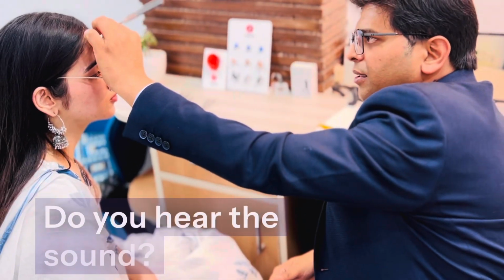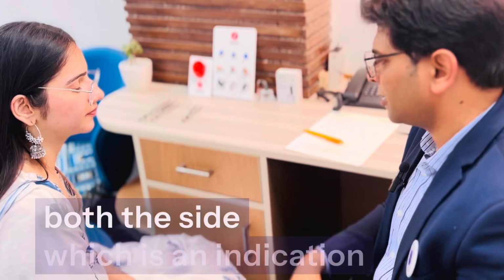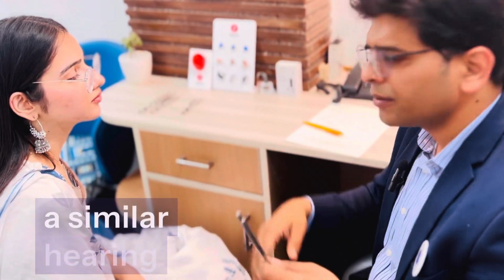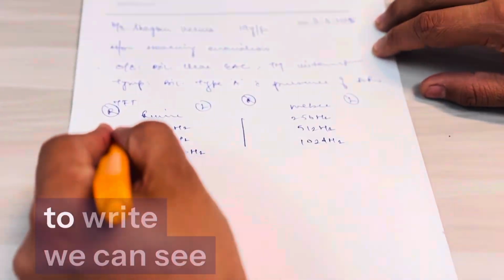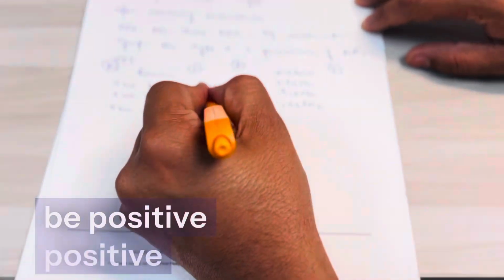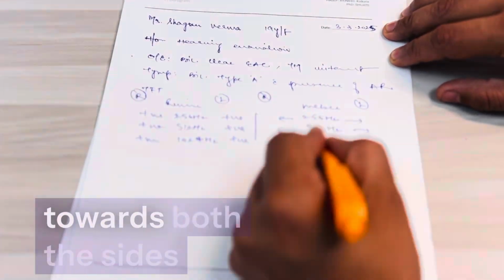Conducting the Weber test. Do you hear the sound? Which side are you hearing it? Both the sides, which is an indication both the ears have similar hearing. So after conducting all the tests, this is the report we are going to write. We can see the Rinne findings coming out to be positive, positive, positive, and the Weber is lateralizing towards both the sides at each tuning fork.